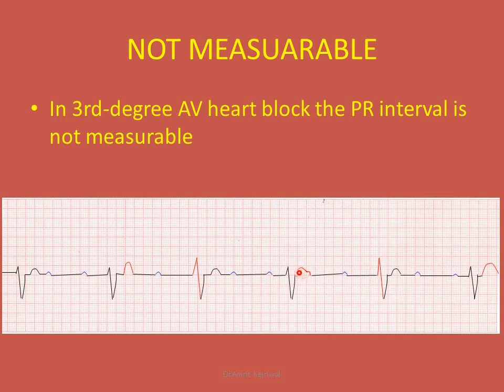Here another P wave has merged with the T wave, and over here merged with the QRS complex. And again here another P wave has merged with the T wave. So it gives varying morphology of the QRS complex wherever it's merged, and the T wave also has a varying morphology wherever it has merged.